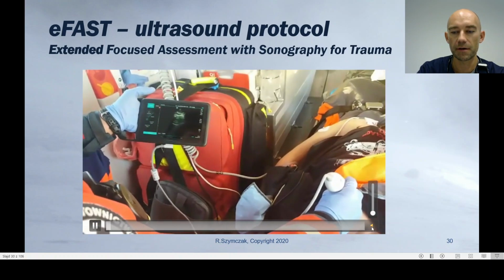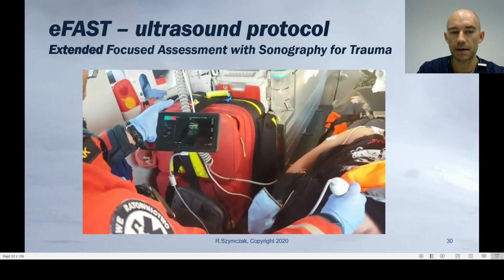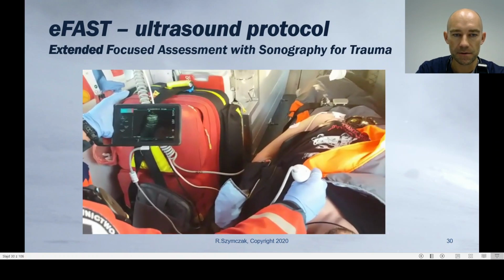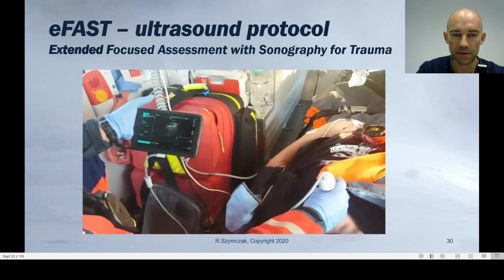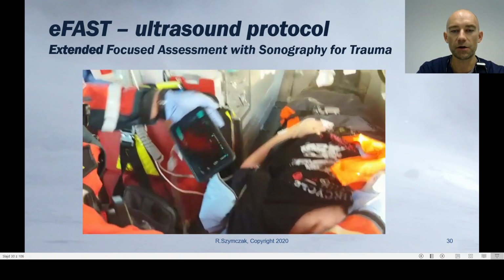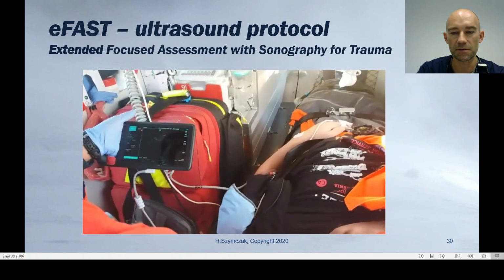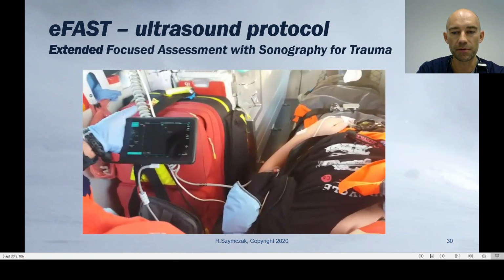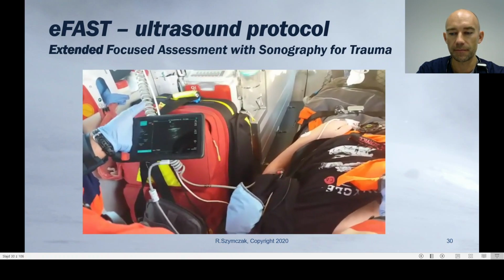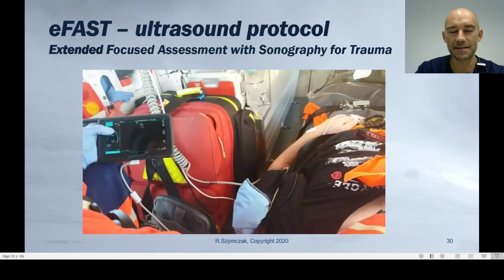And here I'll show you myself performing the ultrasound. It's in a helicopter. So in a moment I will turn on the voice. So I'm performing the examination of the lungs. I just reassess the patient. So that's the head of the patient in the helicopter. The position of the doctor is not as in the hospital, so you have to put a prop in the proper place. That's the monitor, so it's quite handy. And it's quite noisy inside a helicopter also.